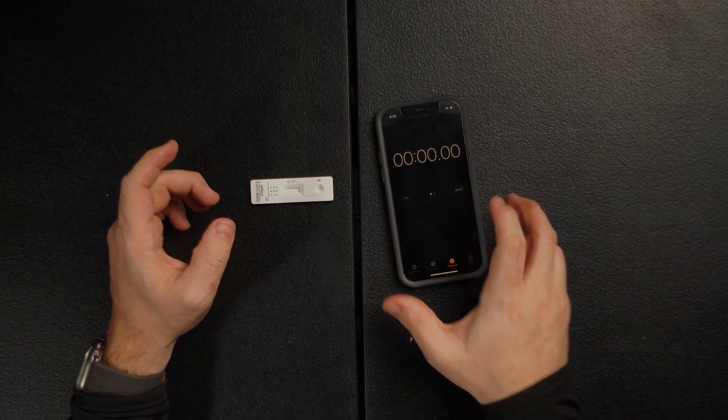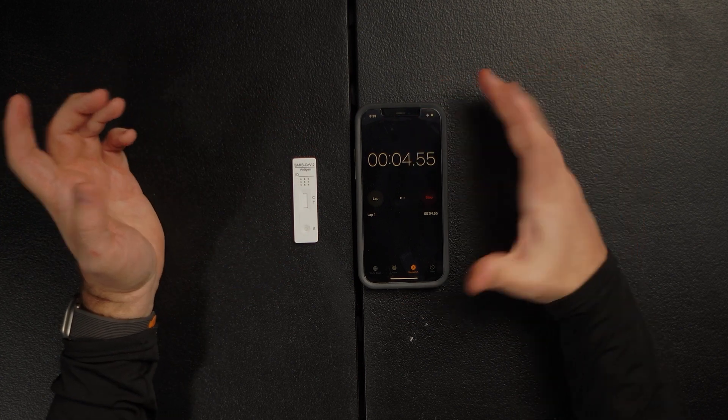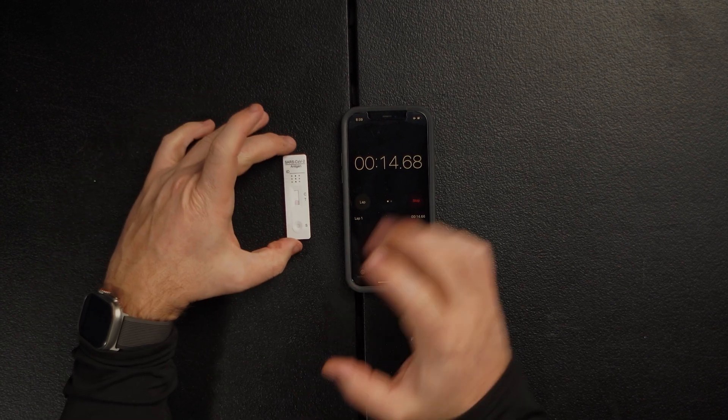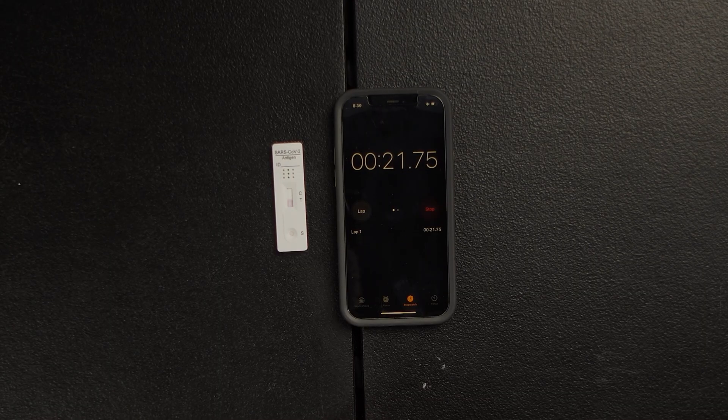Ready? One, two, three drops. If you go over it's not the end of the world — in some cases I feel like you get results even faster. Let me start my stopwatch. The liquid is now going up the strip. We are at 20 seconds and I just passed the T, and T is showing a magenta color saying I have COVID-19.